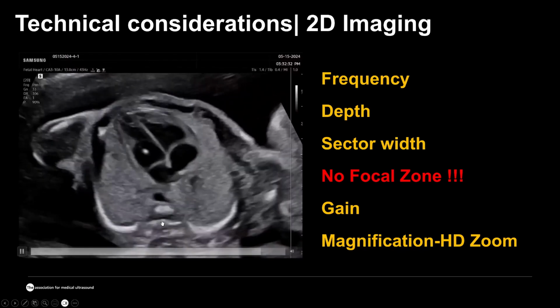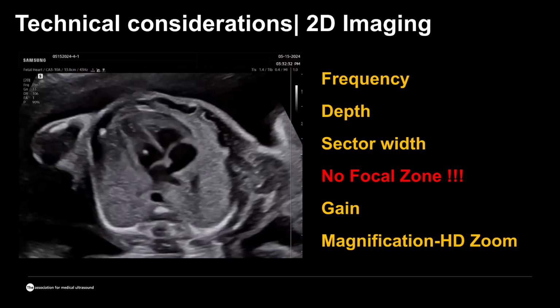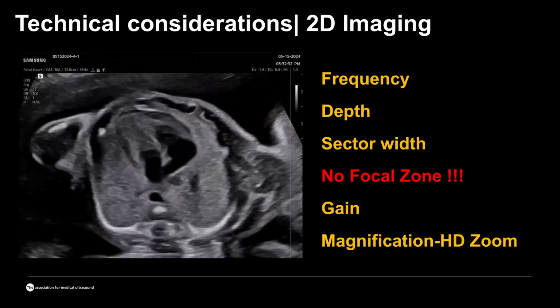And the placement of the focal zone is actually not possible anymore. So you cannot really see that control. So that is the greatest achievement. And actually, from the standpoint of the physics of the ultrasound, this is a revolutionary step.